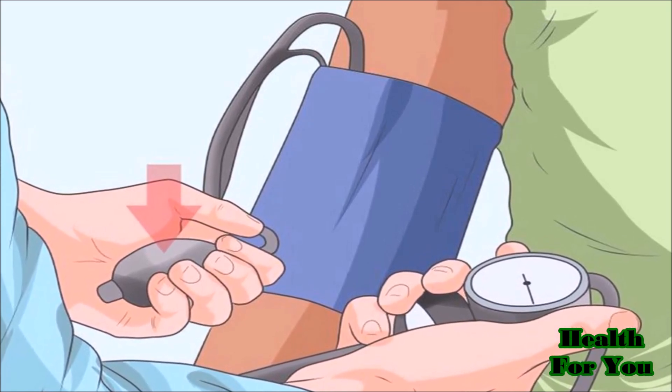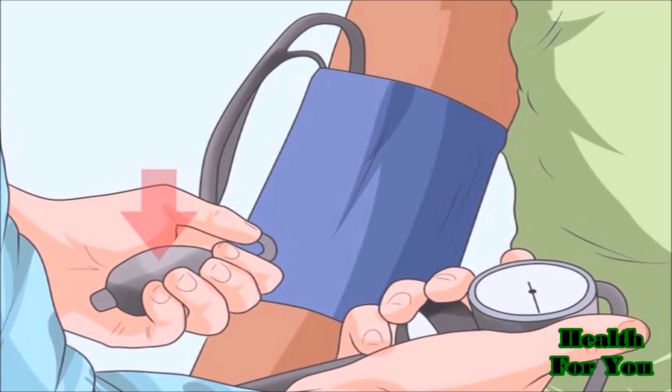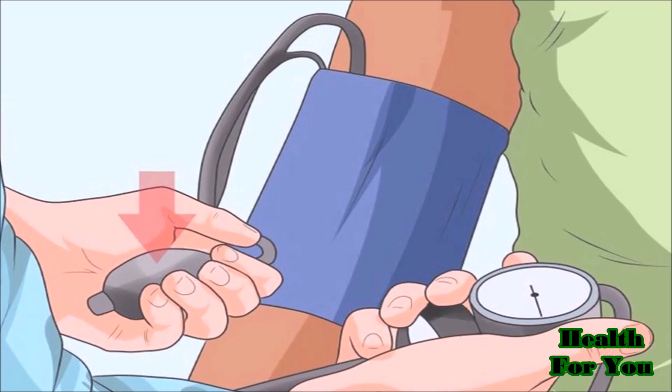Then rapidly pump the bulb to inflate the cuff. Keep pumping until the needle on the gauge reaches about 160 to 180 millimeters of mercury.